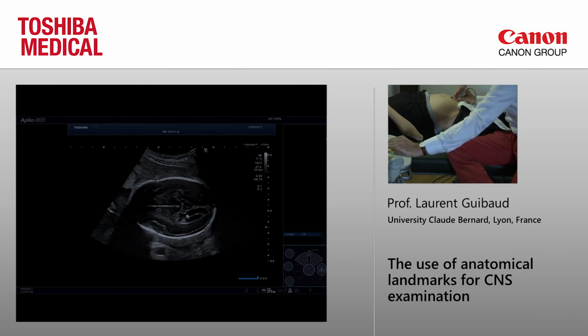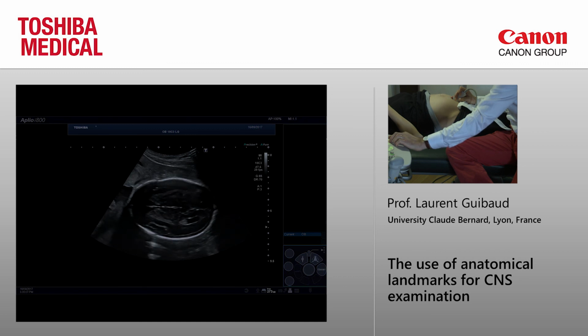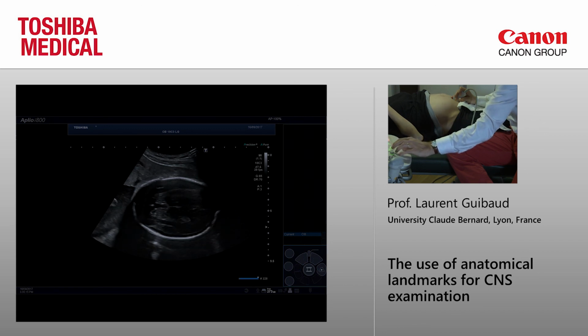This is a V shape with subarachnoid spaces, which is the ambient cistern. And here this is the fornix column, and just above you have the cavum septum pellucidum. And you see that for the cavum septum pellucidum, the AP diameter should be larger than the transverse diameter, because if the AP diameter is shorter than the transverse, you may deal with callosal agenesis.